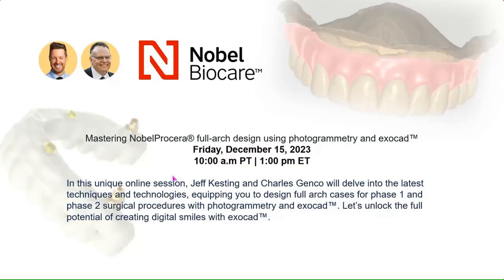So we're going to have a lot of fun, and Chuck's going to get right into that software at the end. We're going to do a little bit of an overview, so you really get to see how this entire workflow works, basically for a digital all-on-4.